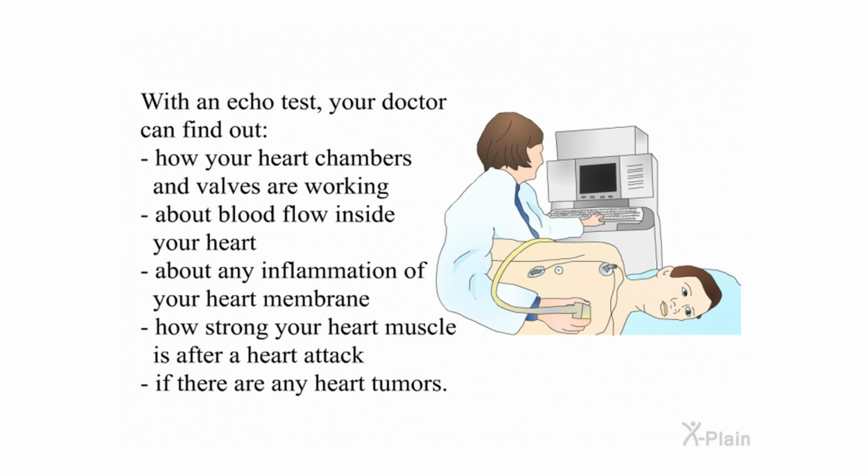With an echo test, your doctor can find out how your heart chambers and valves are working, about blood flow inside your heart, about any inflammation of your heart membrane, how strong your heart muscle is after a heart attack, and if there are any heart tumors.